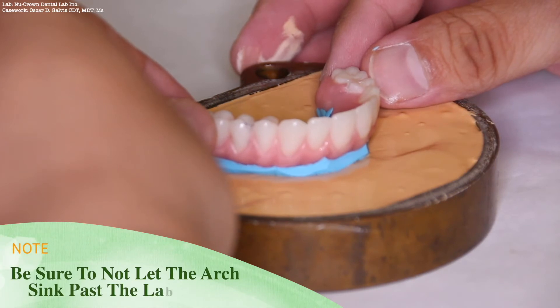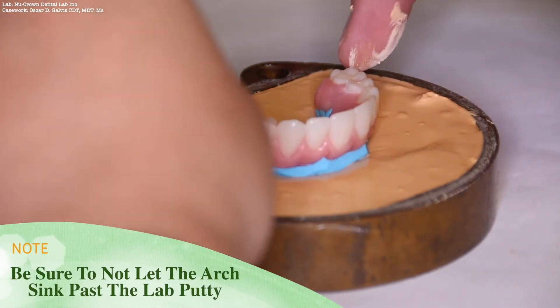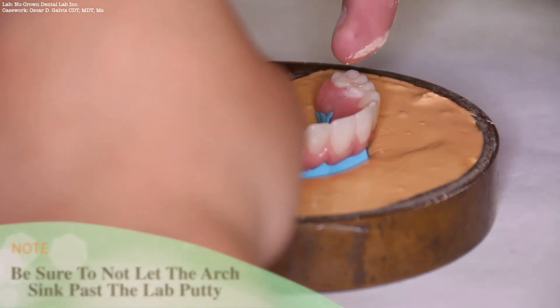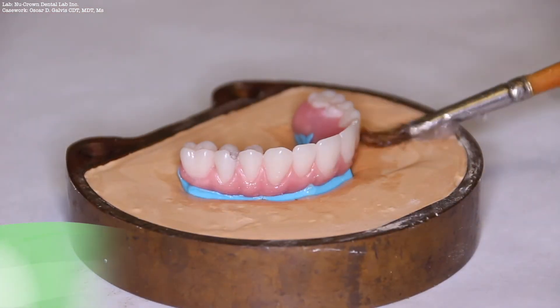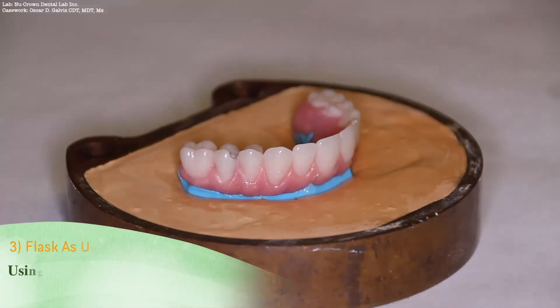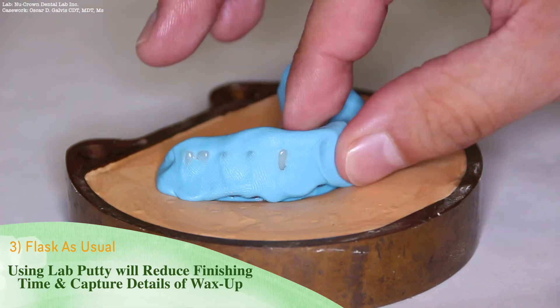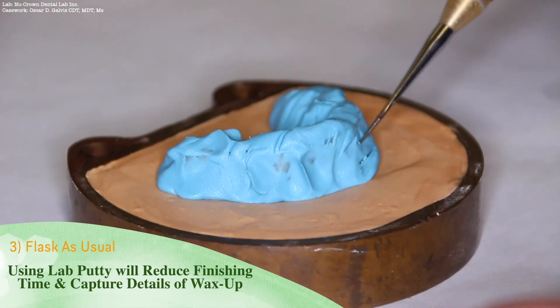When performing this step, be sure not to let the arch sink past the lab putty, as this will affect the aesthetics upon deflasking. After this step, using lab putty can reduce the finishing time and capture the details of your wax-up. You may use this procedure and flask as usual.